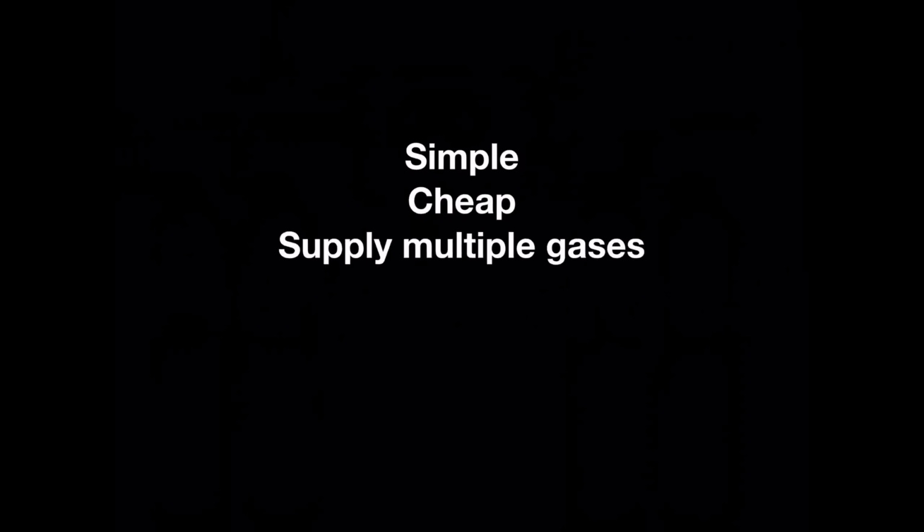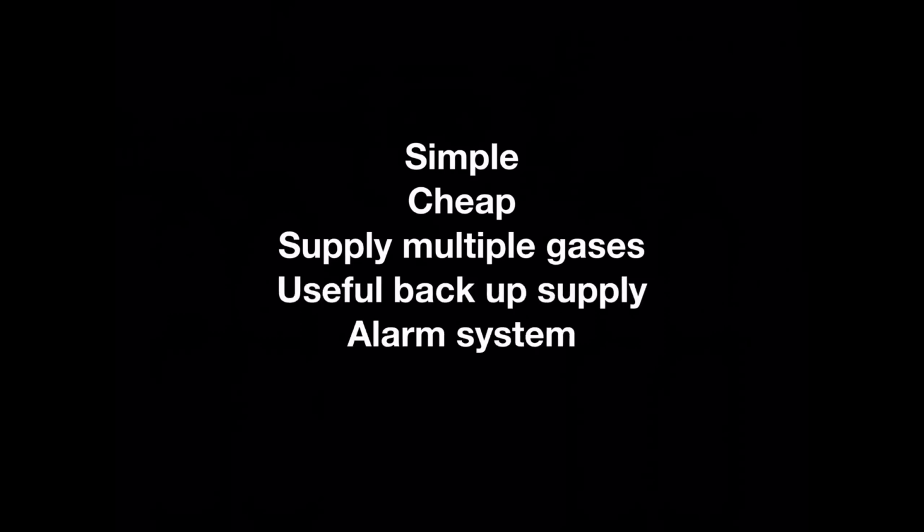Some advantages of the cylinder manifold. It's a very simple system. It can be cheap. It supplies multiple gases, for example, nitrous oxide or oxygen. It has a very useful alarm system, which means that the user is aware of when the cylinders are empty.